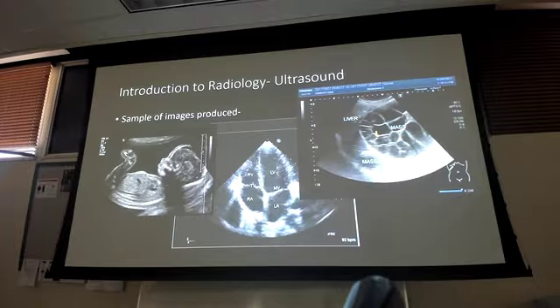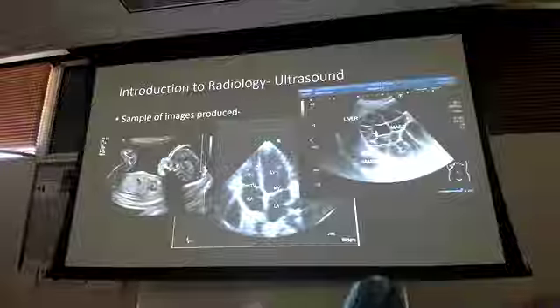So what we have on number 1 is baby, okay? What we have on number 2 is the heart. And what's interesting here, you're like, whoa, the ventricles are up towards the top, but I learned that the atria are at the top.